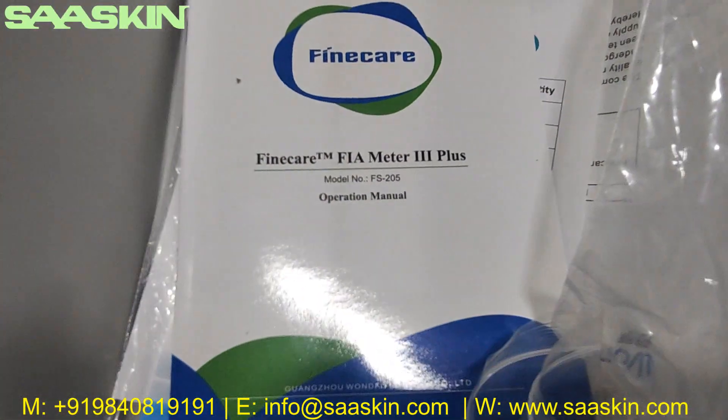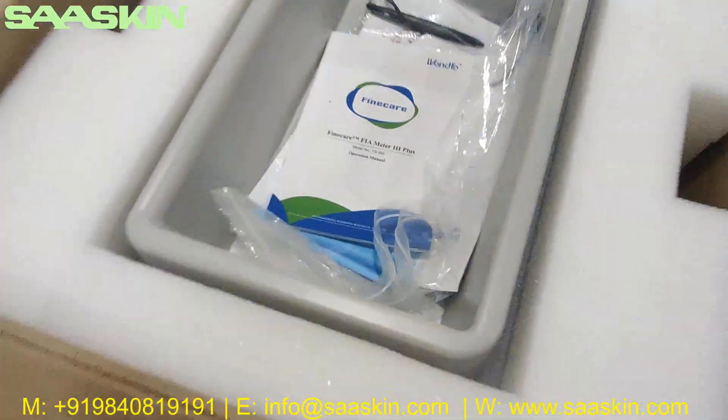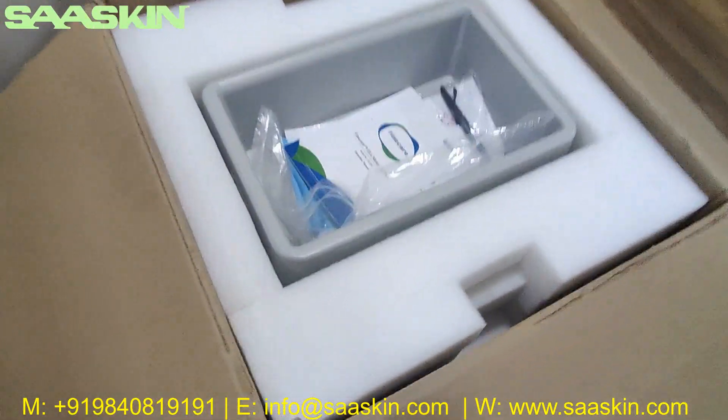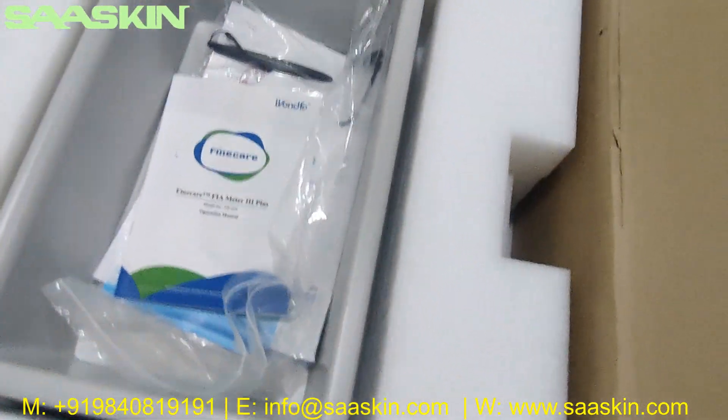This is how it looks when you open the carton. I'm going to show you the contents inside and we'll go through them one by one.